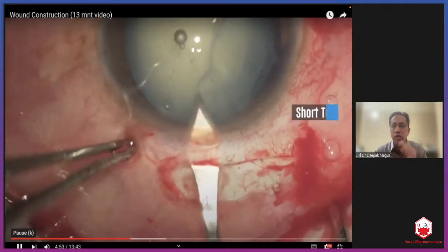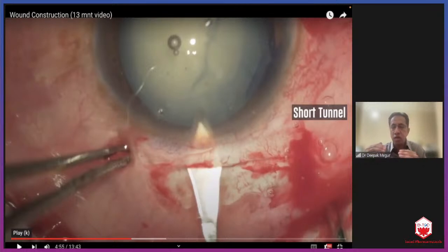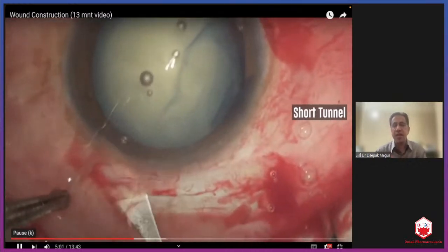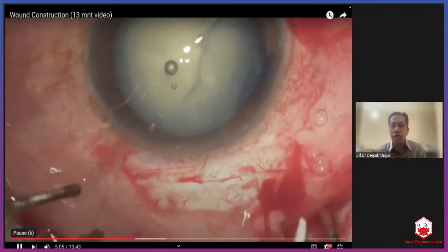So the concept of having an inner corneal wall, the surgeon doesn't have this. He's very eager not to go into the cornea. So what he's doing is basically trying to enlarge the incision, and the way he's cutting inside, the inner lip is always running towards the limbus.